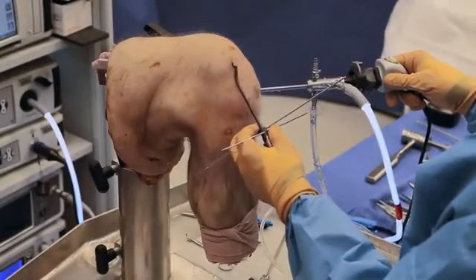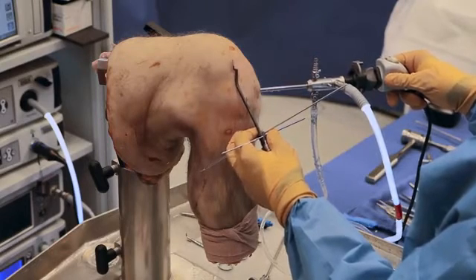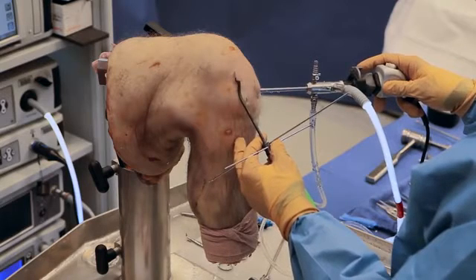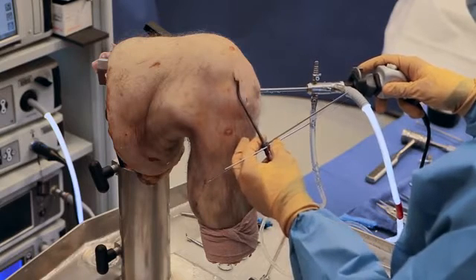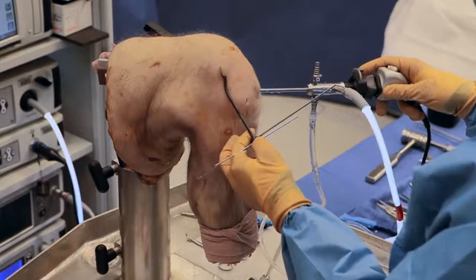So this is the precision flexible reamer guide system from Biomet. As you can see, it's got an angle to it, and it's got a foot which captures the back wall so that our tunnel does not blow out the back wall. It's also got two alignment options. One is coronal and one is trajectory.